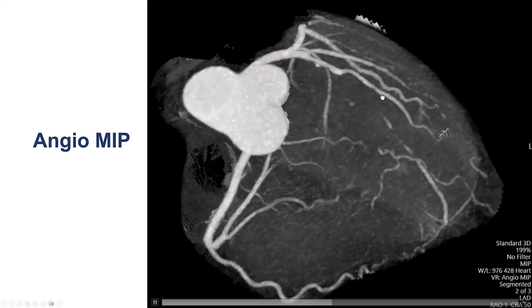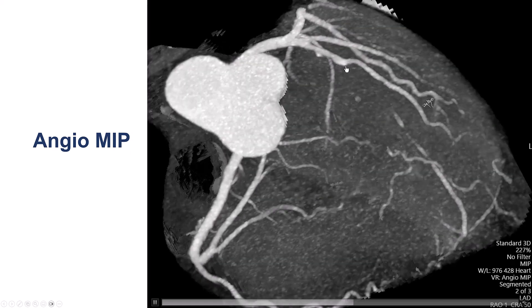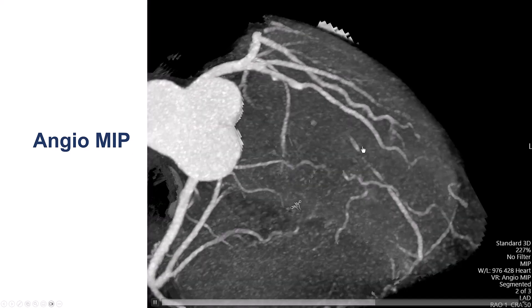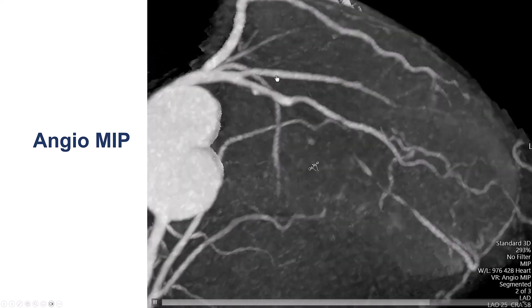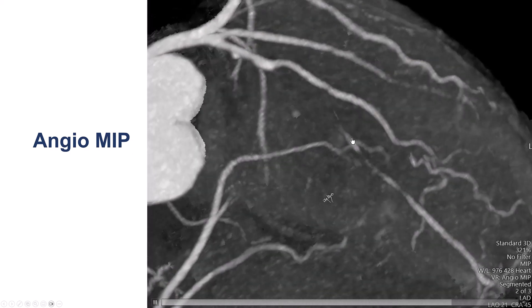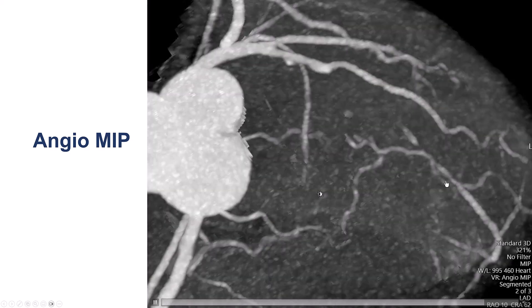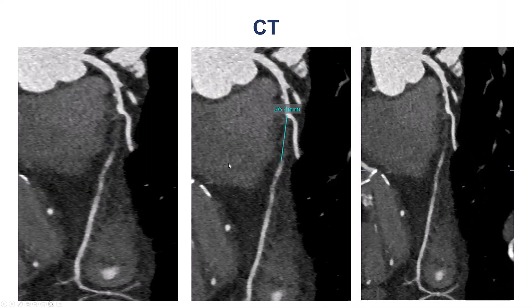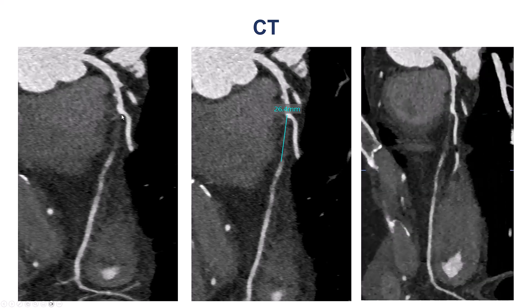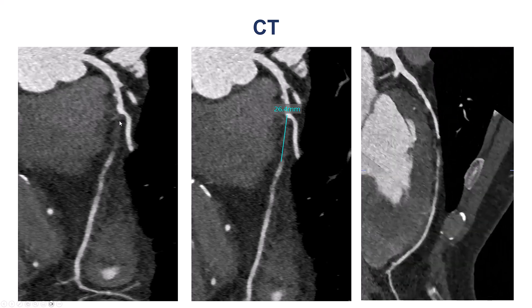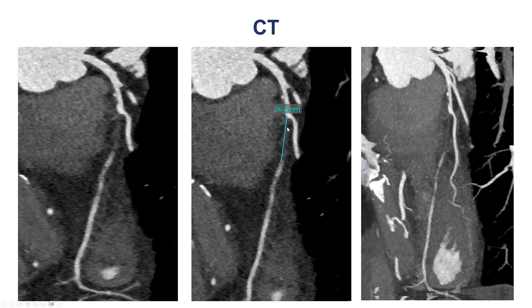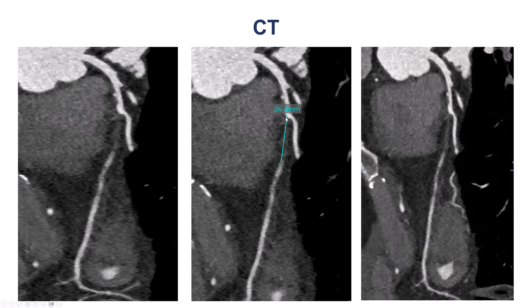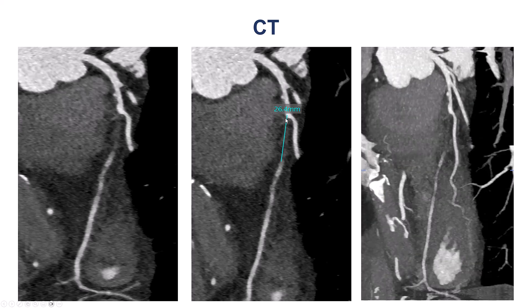So this is the LAD, this is the diagonal branch, this is the proximal cap, and this is the occlusion length. This view is very useful because we can see what angulation can be optimal for visualizing the occlusion. CT also helps us visualize the distal vessel, which has some diffuse disease. We don't see much calcium, which is a good prognostic factor for crossing the CTO. The length was about 26 mm, and CT is probably more accurate than coronary angiography for measuring the length of the occlusion.